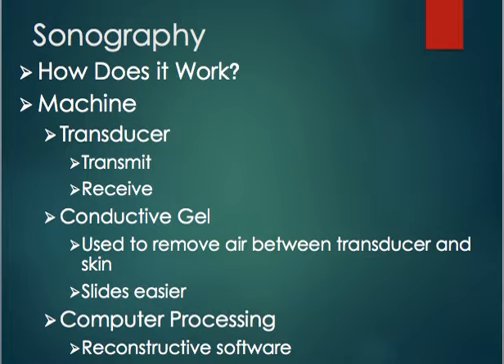So the ultrasound transducer produces a stream of inaudible high-frequency sound waves which penetrate into the body, bounce off those organs inside, then the transducer detects those sound waves as they echo back from the internal structures. And then it contours the shape of the organs.